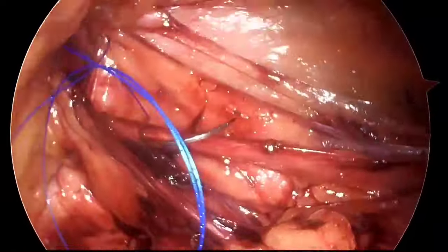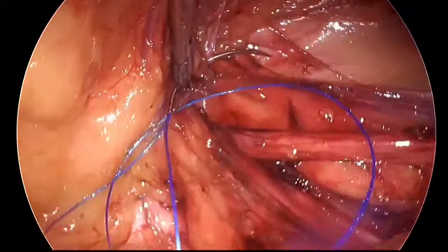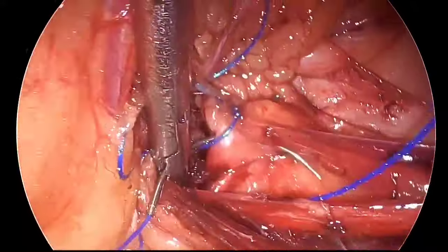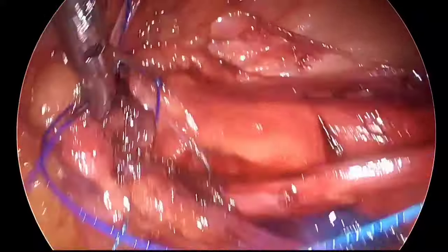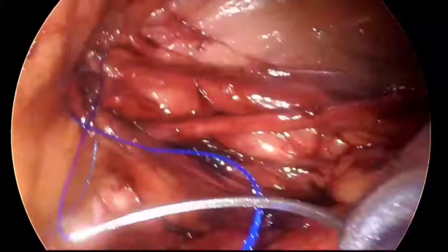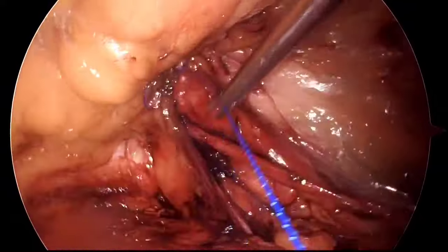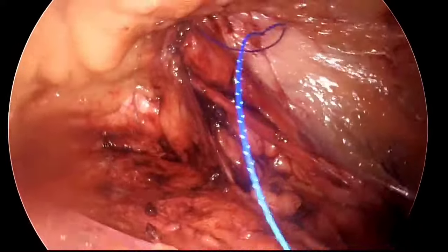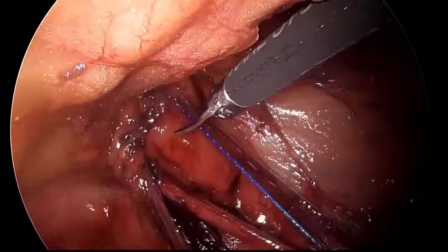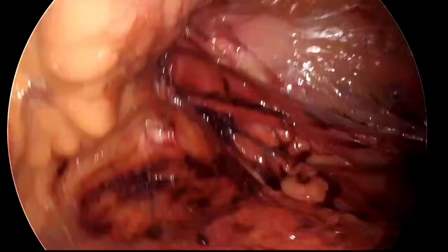While taking the bites, we should take care that there is no injury to any important nerves or vessels, as that can cause bleeding or postoperative pain. This suturing is important to narrow down the defect. Here you can see I have narrowed down the defect, but there should not be any tight closure that can impinge upon the cord structures. That should be taken care of.